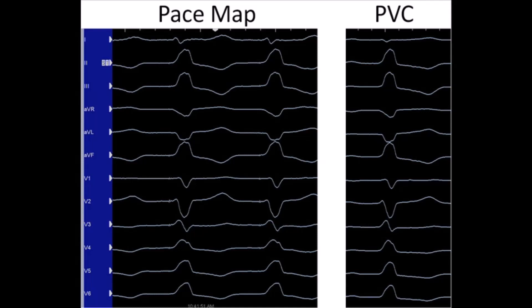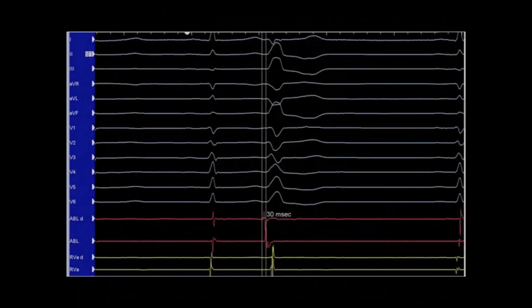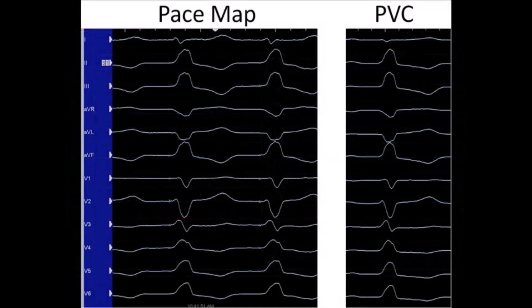Ablation is successful when performed at the earliest ventricular activation location, which is usually greater than 30 milliseconds prior to QRS onset. A QS morphology on the unipolar electrogram should be seen at this location. A 12 out of 12 pace map should also be seen.